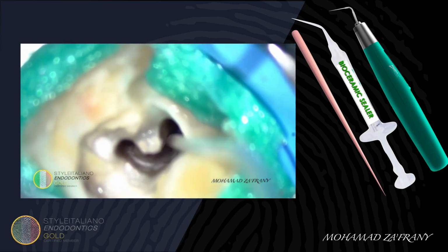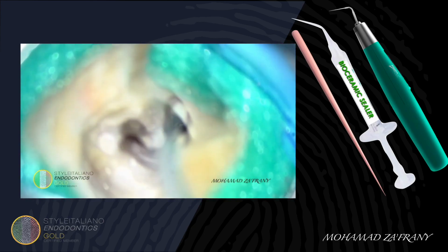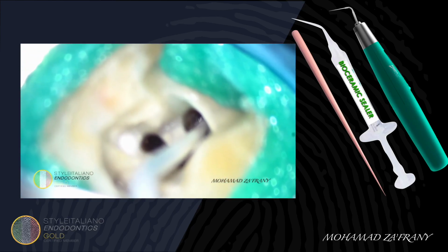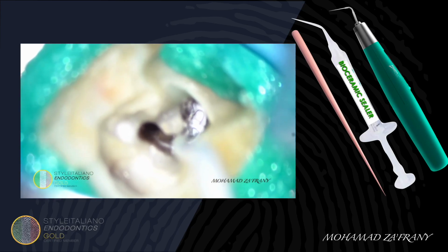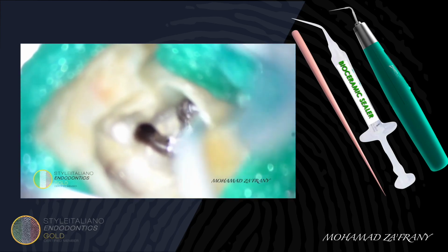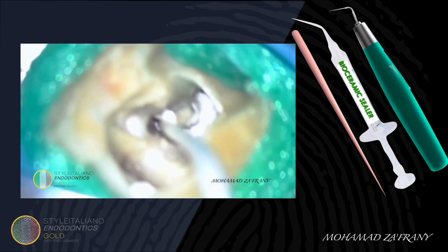After drying the canal, I am putting my bioceramic sealer into the canals. For sure, some moisture may be remaining in the isthmus area. That's why the bioceramic obturation technique is preferred in this kind of case. Here is the bioceramic.